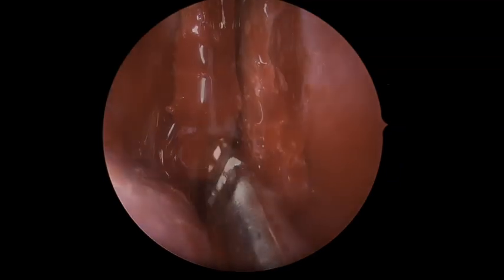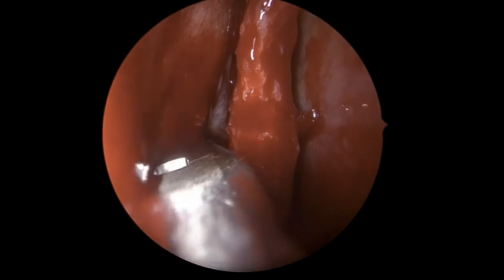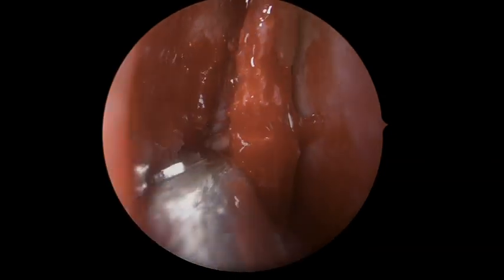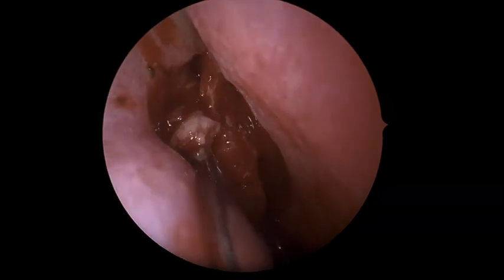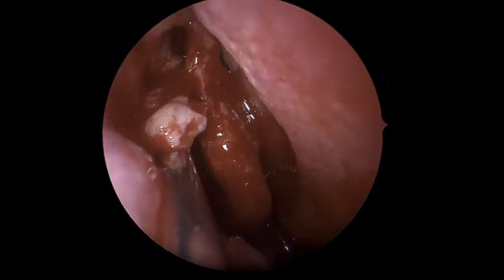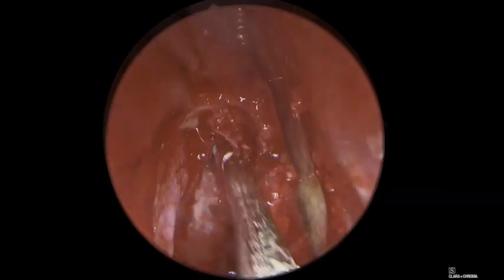After reduction of the middle turbinate, we proceed with the retrograde inferior uncinectomy using a backbite forceps. From an anatomy-driven surgical perspective, we currently do not rely on rigid light probes to locate the projection of the lacrimal sac on the nasal mucosa.